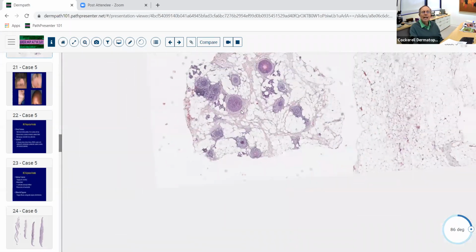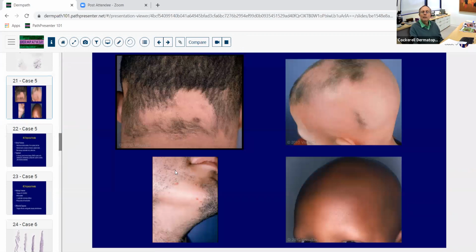So this is AA, and you all know what that looks like clinically. There's lots of different manifestations. Alopecia universalis, where you'll get no inflammation, no residual hair follicles, just little fibrous stelae. If you were to biopsy something like this, you'd probably see something more like what we're seeing today. If you biopsied something like this, again, you might see more than one kind of pattern in there. You might see an area that's kind of late stage and burned out.